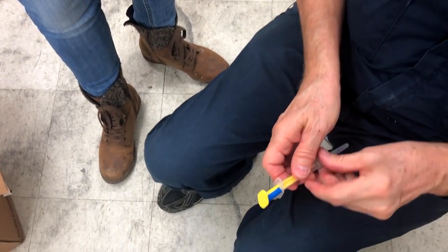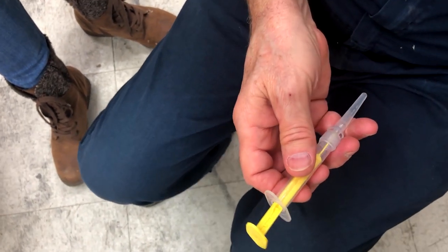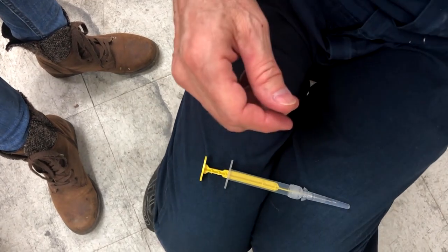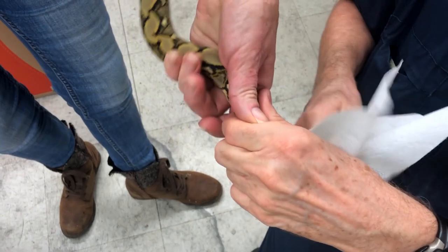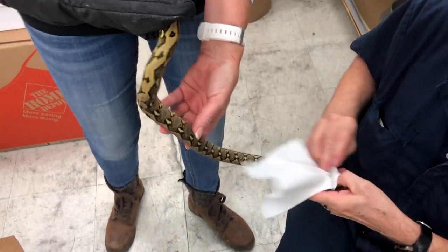You have to take out this little thing right here, because that's kind of a safety to keep it from pushing the little thing out. Let me get some alcohol and wipe this little guy off a little bit.